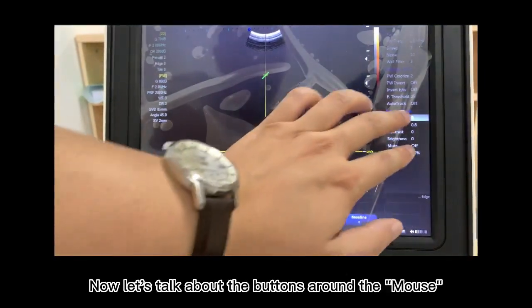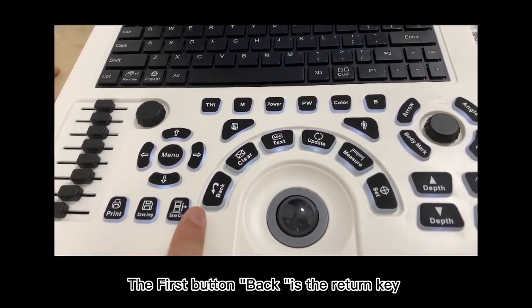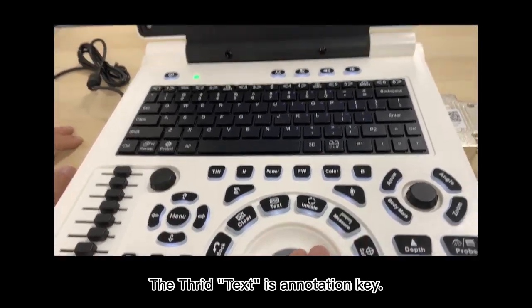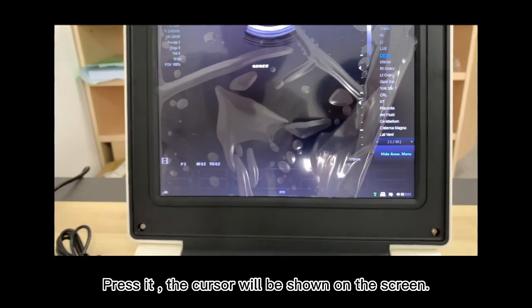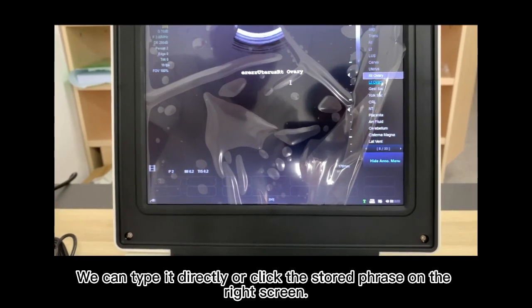Now let's talk about the buttons around the mouse. The first button, back, is the return key. The second button, clear, is for clearing the screen. The third, text, is the annotation key. Press it, and the cursor will be shown on the screen. We can type directly or click the stored phrase on the right screen.